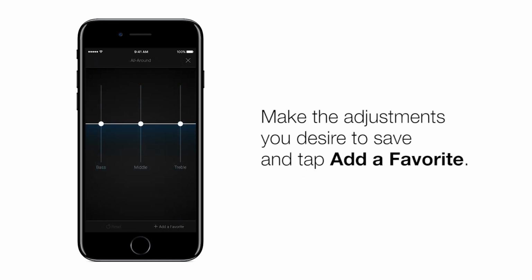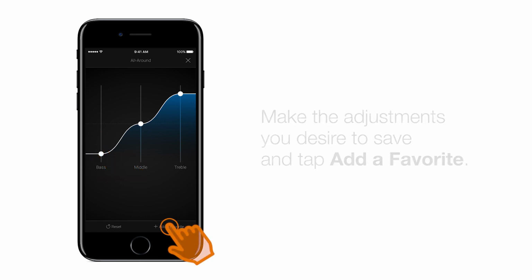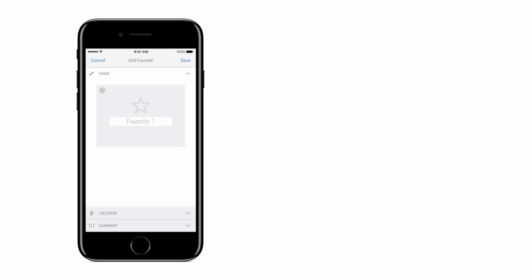Make the adjustments you desire to save and tap Add a Favorite. A finger slides the treble dot up a vertical line and slides the bass down. The finger points to the Add a Favorite button on the bottom right.